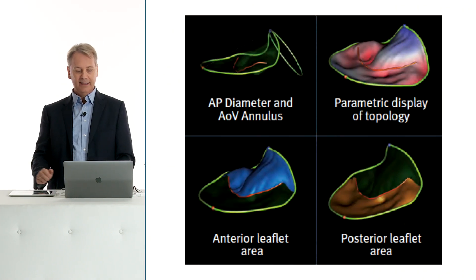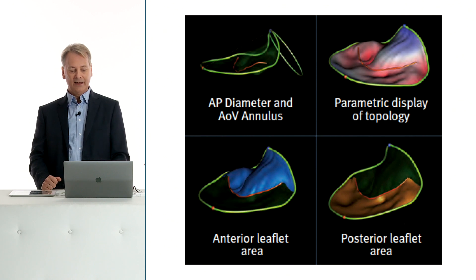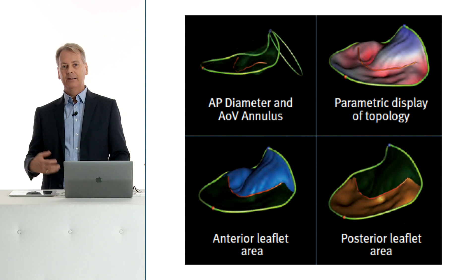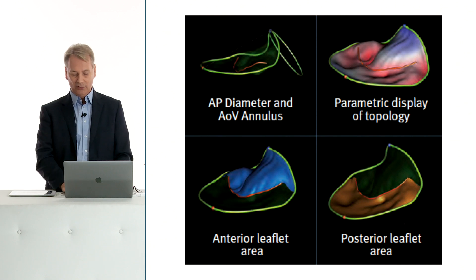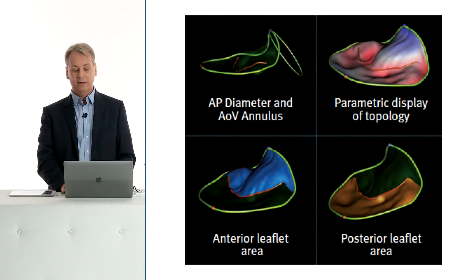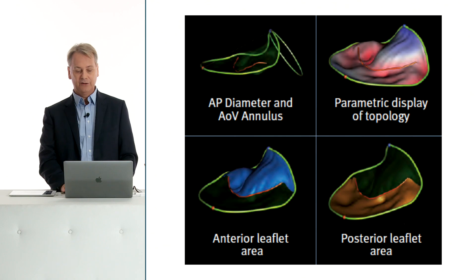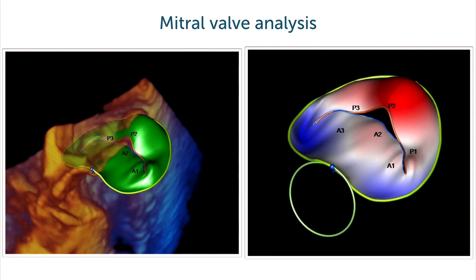Another way of looking at it: you can also assess the aortic diameter and the aortic annulus — an important way of deciding which size of prosthesis to use in TAVI patients, for example, and also how the interaction between the anterior leaflet and the aortic valve is.